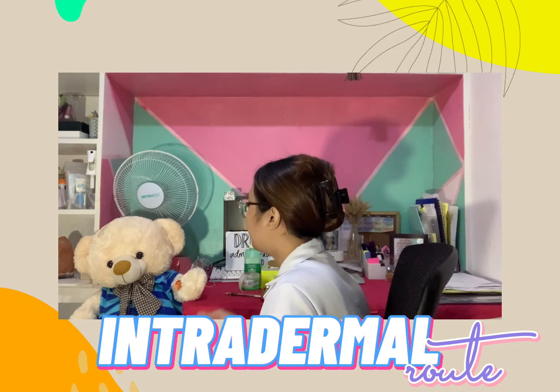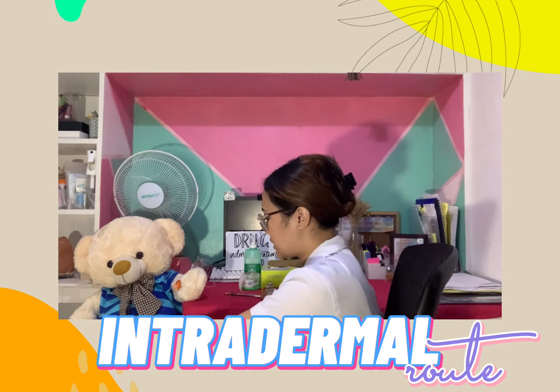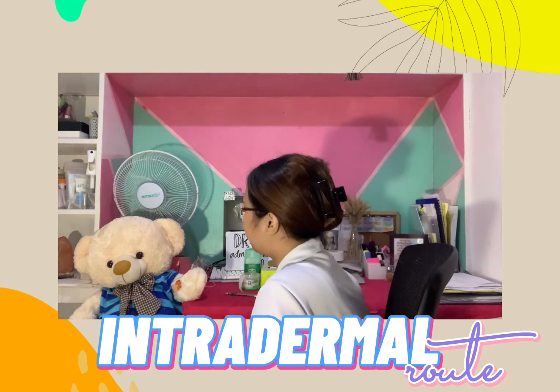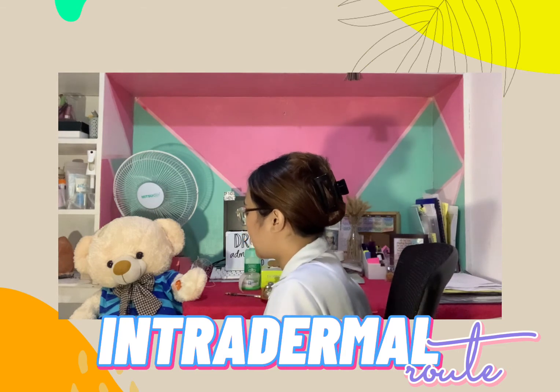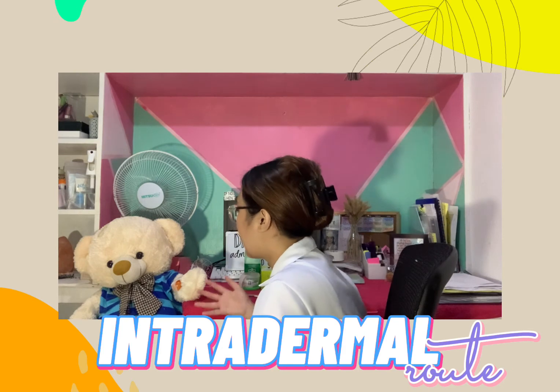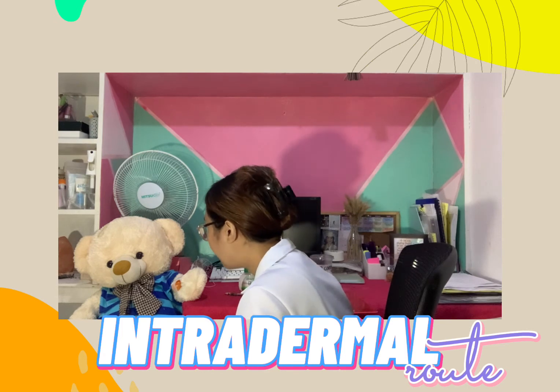You will feel a little discomfort po because we are going to perform the skin test po. In your skin, we will form a bleb po or a wheal, and if there is any redness present on the area where we perform the skin test, you acquire po the allergy on the said medication. Is that okay with you po, ma'am? Will you cooperate with me po?